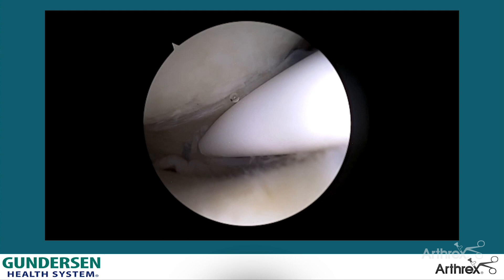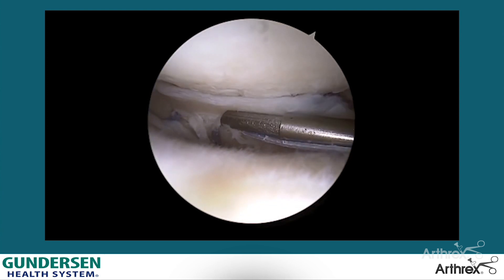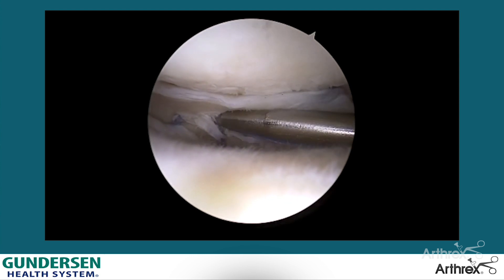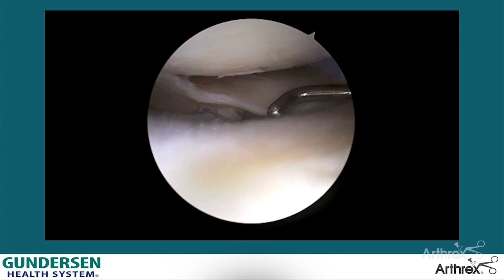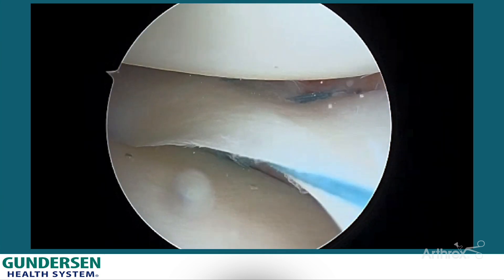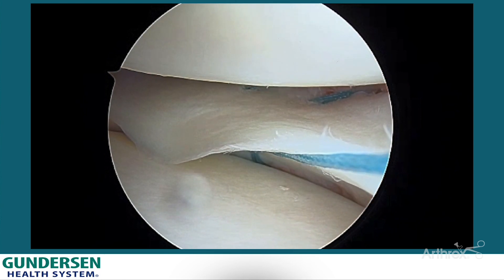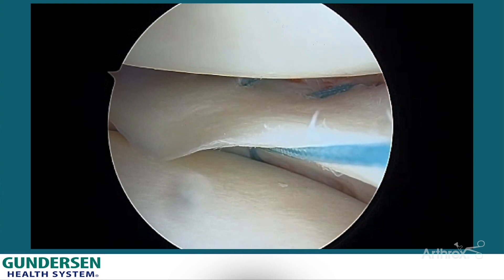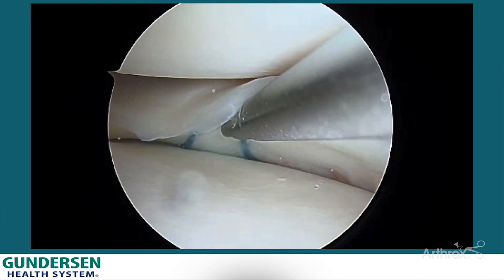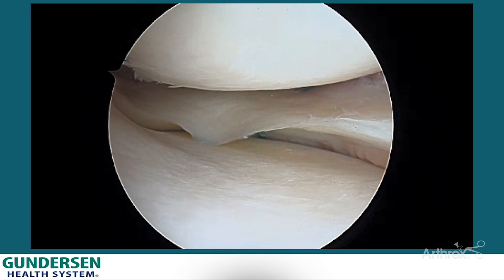I really like that technique - putting the superior stitch first to flip the meniscus up, then using the opposite curve device to optimize penetration and get two stitches to reposition it in the more anatomic position. The nice part about the Fiber Stitch is the versatility of these multiple curves. You can see the probe on the end where we're getting the meniscus to lay nice and flat. Here's another example with a more true meniscal capsular tear in the back - 12 degrees on top and reverse curve on the bottom - and you can see that really nicely anatomically positions the meniscus with an anatomic repair and excellent seal against the plateau.